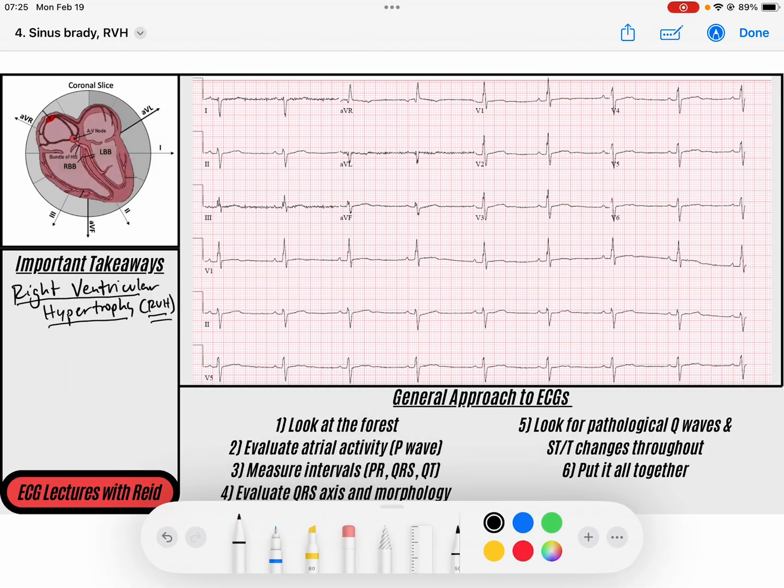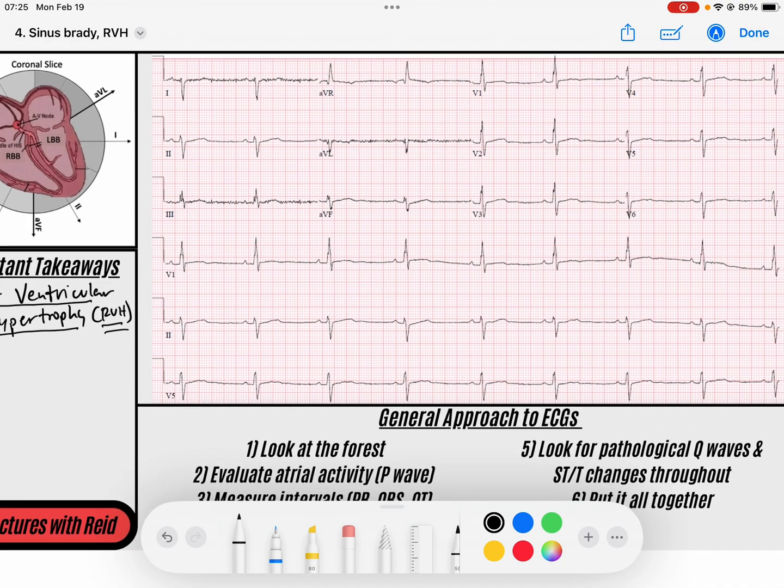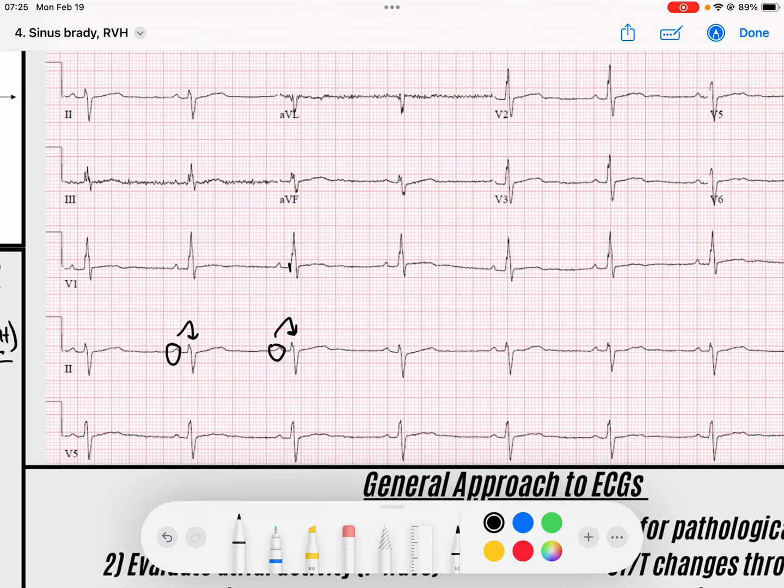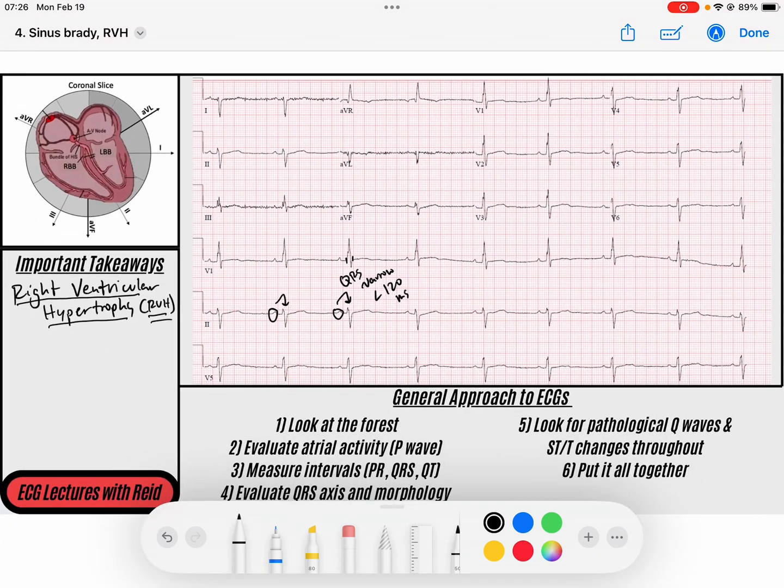Let's take a look at our ECG that has to do with right ventricular hypertrophy. In this case, we've got a sinus rhythm. Our P waves are conducting to our QRS complexes. When I look at my QRS, I see that it is narrow. My QRS is narrow, less than 120 milliseconds or less than three small boxes.